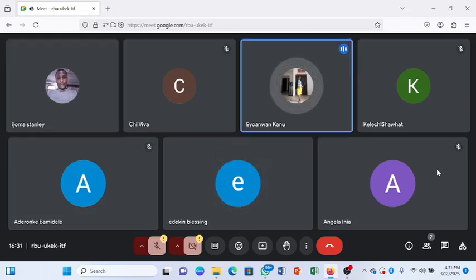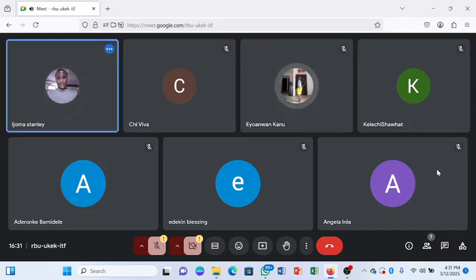The truth is, I don't really know which one is small. 5 mil or 2 mil, okay. Each time you want to take an injection, they will just put it and tell you to turn your bum, so I don't know which one is 2 mil or 5. Okay. Now, the smallest syringe, that small one that has a blue needle, is used mostly in pediatrics. They have a bigger one of 10 mils, which is a bigger type of syringe.